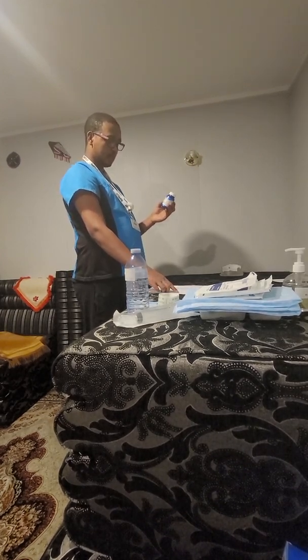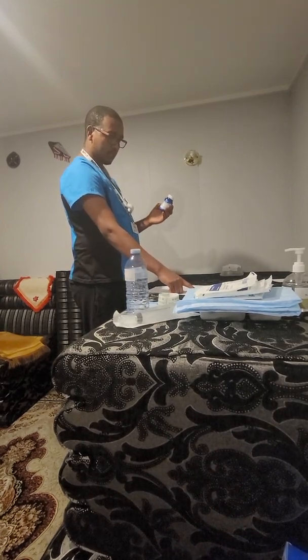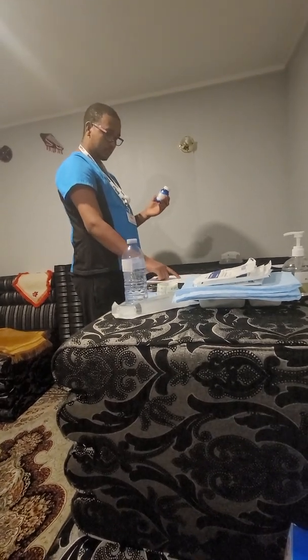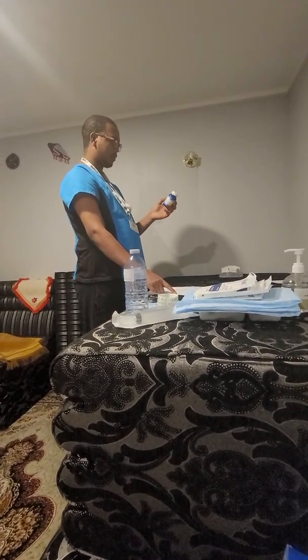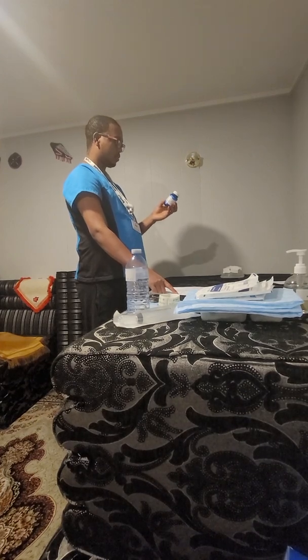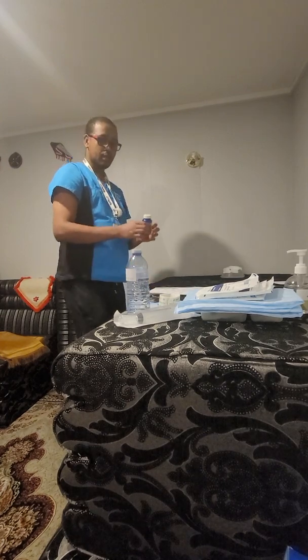Wound of Mr. Deep. Third check, patient name is Stephen Deep, date of birth 1980 November 29. Action is pack abdominal wound with 0.9% sodium chloride soaked half-inch wide plain packing strips once a day and PRN. In my hand I have half-inch wide plain packing strips. Expired date is January 21st, which is good to use, and I'm going to use it to pack the abdominal wound of Mr. Deep. Okay, I've done my three checks.